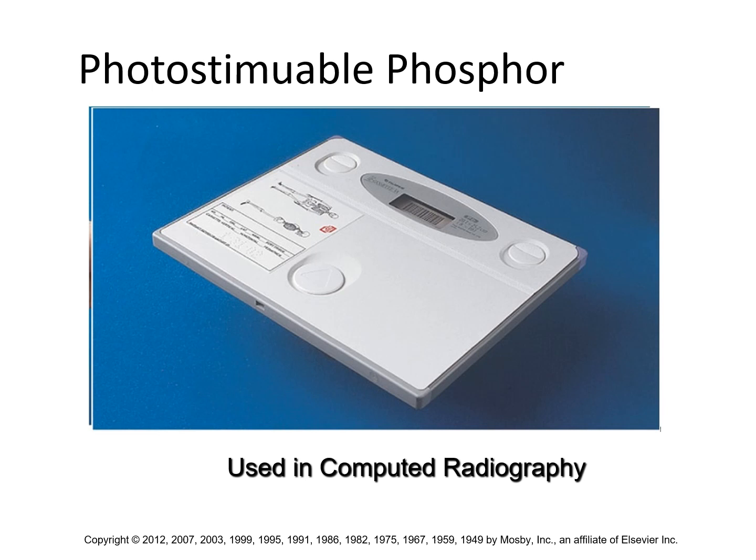Okay, so that's the advantage of the DR technology, is we don't have to carry the detector anywhere and start processing it. The data from a DR will automatically transmit to the processing software and begin processing automatically. Whereas CR technology, you capture the image and then you take the cassette to another machine called a CR reader or a CR processor, and you have to process and extract the image in a second step.